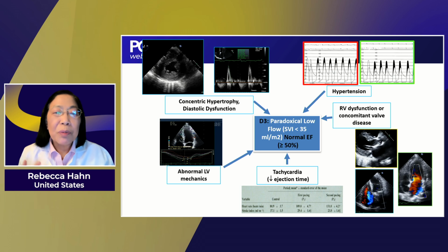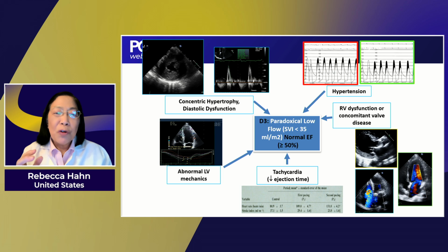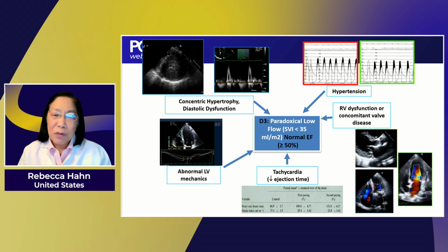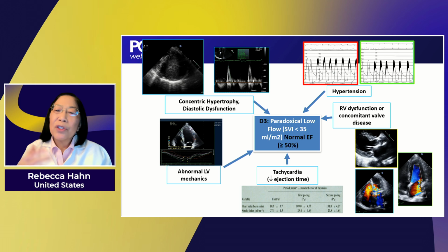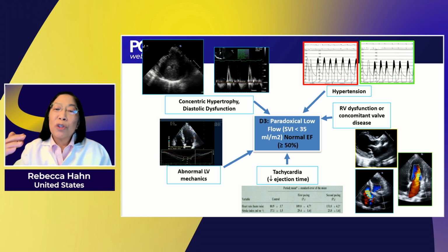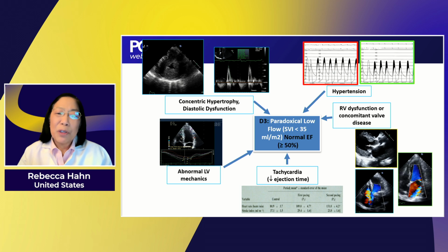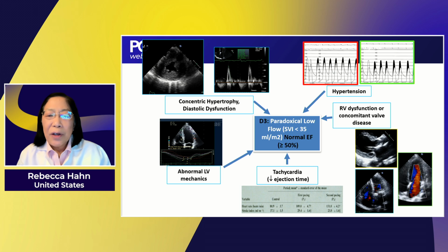Possibly the most common is going to be concentric hypertrophy with a very small ventricular cavity. But we also know that ventricular mechanics, even in the setting of normal ejection fraction, so low strain imaging, will also give you a low forward flow. Those patients with hypertension, what you see at the top there is an example of a patient that came to our cath lab and was given nipride in order to reduce their hypertension, and then yielded a very high gradient and high mean gradient with severe aortic stenosis. So hypertension, another reason for low flow, low gradient paradoxical aortic stenosis.